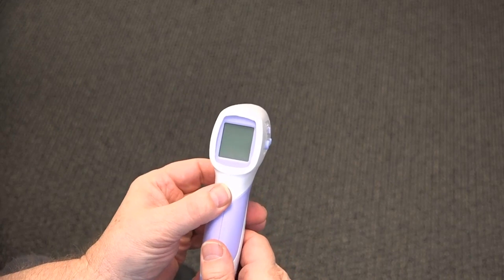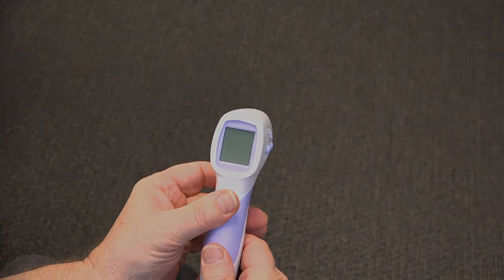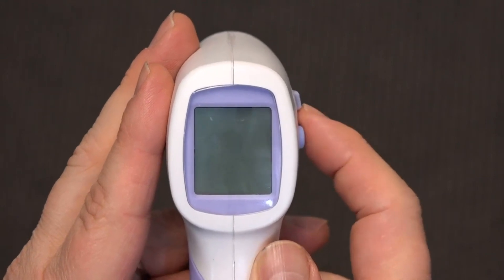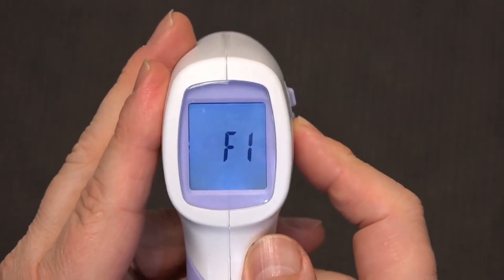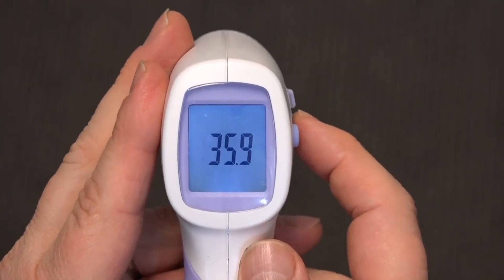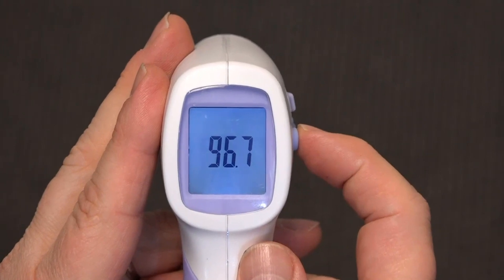In order to use the thermometer, you must first calibrate the device. By default, the unit comes in Celsius scale. Press and hold the mode button. F1 is displayed. Use the up or down arrows to switch from Celsius to Fahrenheit or from Fahrenheit to Celsius.